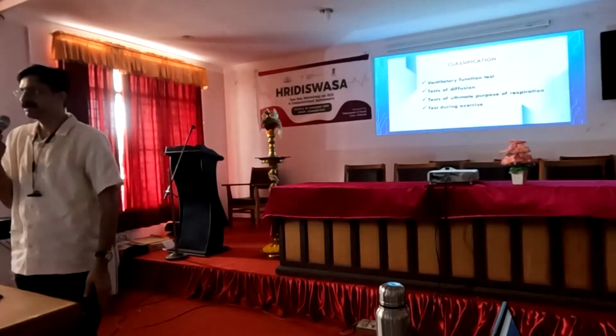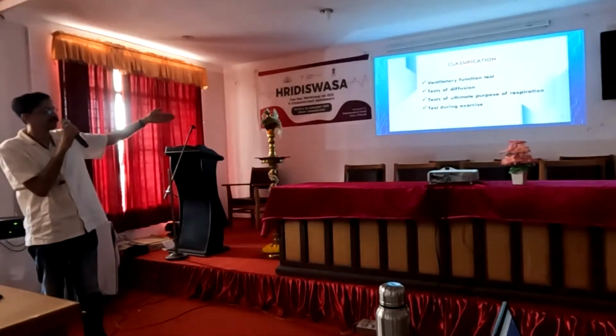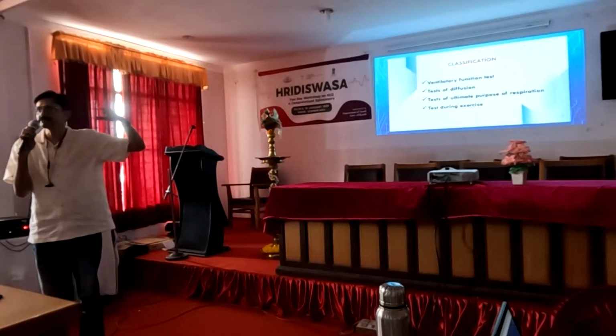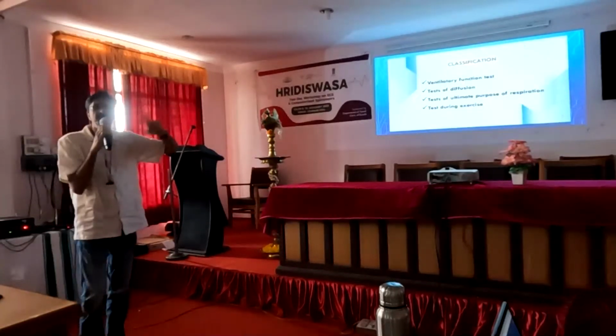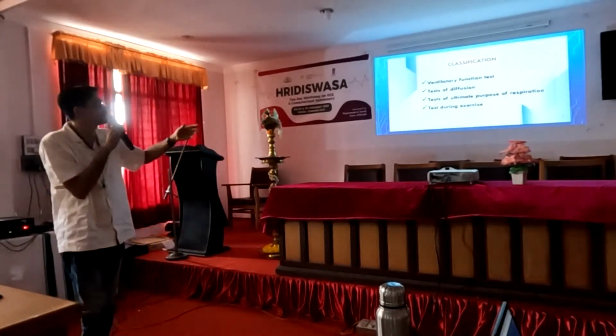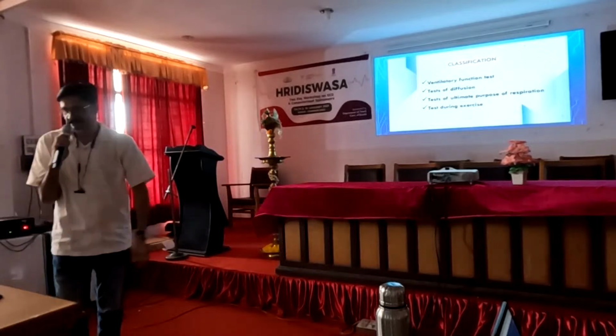The major classification is ventilatory function test and test for diffusion. The ventilatory function test depends on ventilation. Test of diffusion assesses the diffusing capacity of the respiratory membrane, then the test of the ultimate purpose of respiration, and the test during exercise.